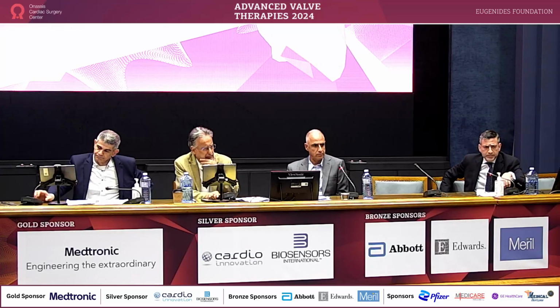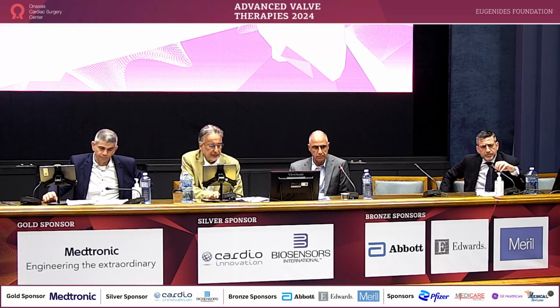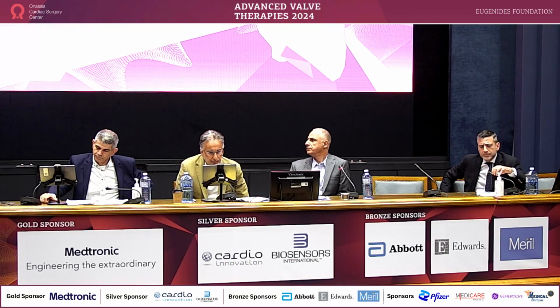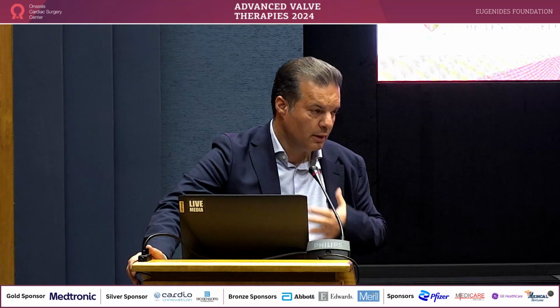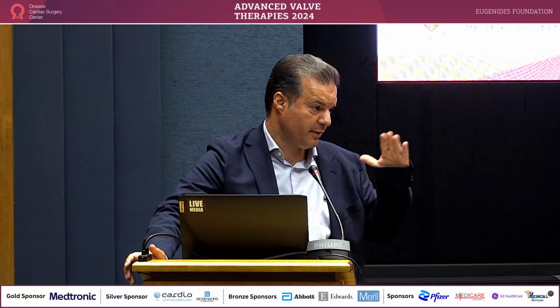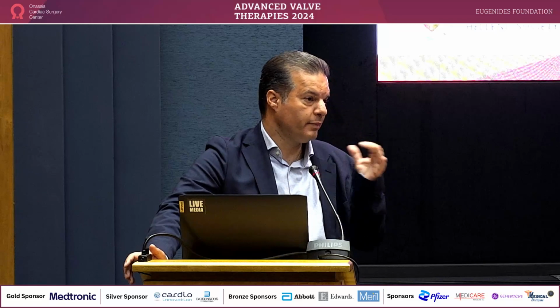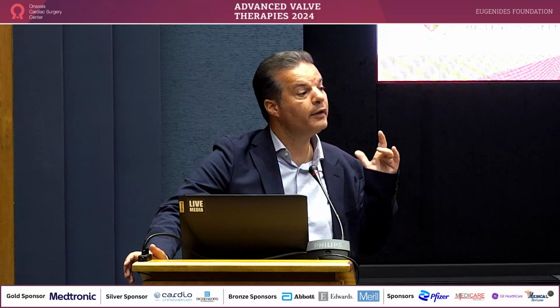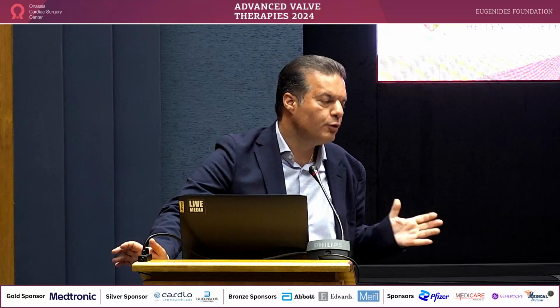So, may I ask a small question? Vlasis, would you wait for these patients to have a specialized valve like Intrepid? I think with this LVOT, from the TMVR devices that I know, the only device probably that could work is AltaValve because of this unique supraannular fixation. But right now, AltaValve cannot accommodate stenosis with small annuli and heavy calcium, only regurgitation. So really, I don't see that we have any other option. If the patient had a less complete calcification, less round calcification, would you still do it?